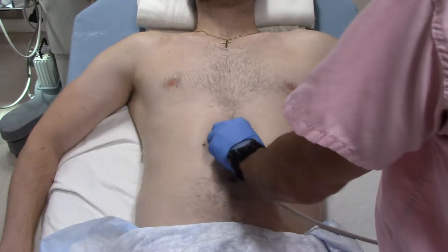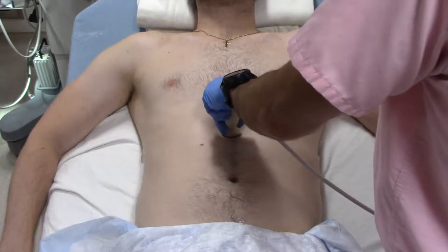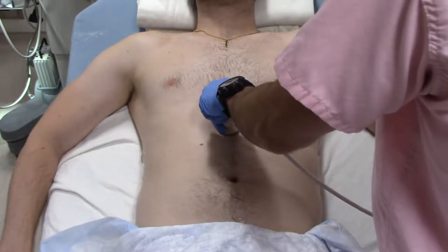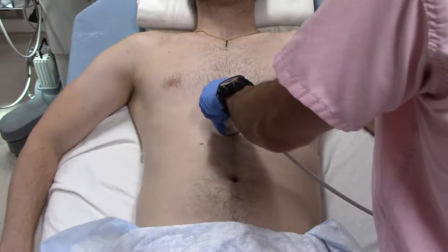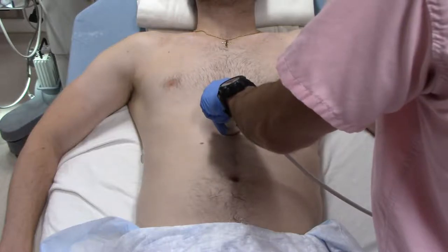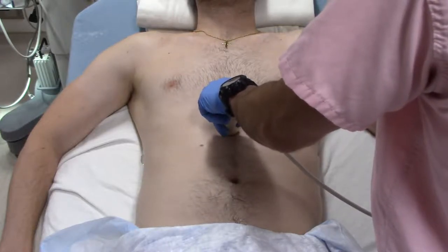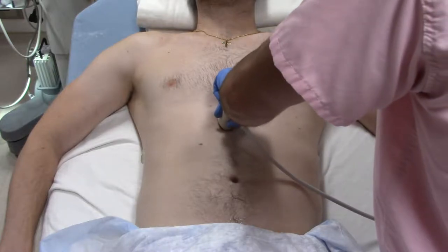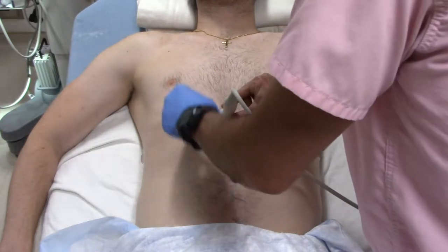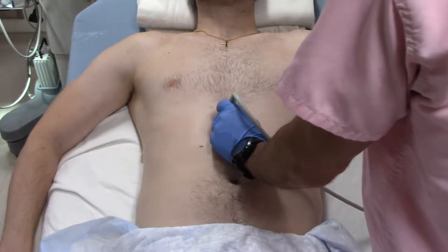From there, we're going to bring the transducer up into cross-section. Bring our depth up a little bit so we can see the aorta and IVC. Indicator stays pointed towards the patient's right — acquire a clip of that. Then rotating the transducer 90 degrees clockwise up towards the patient's head, finding where the IVC enters the right atrium, and acquiring that picture.